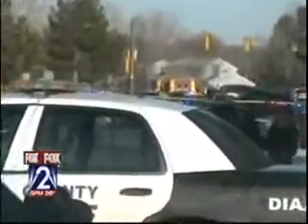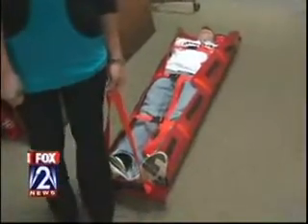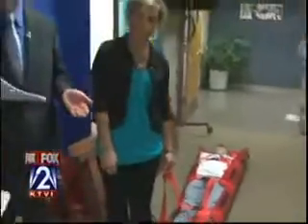And it's emergencies like these where seconds count. Schools are always practicing disaster preparedness, whether it be for a flood or something like that. Yeah, and then occasionally a new invention will come around, and that's what we've got here. They are using this in the Rockwood School District. It's called a med sled, and it's an emergency transportation and evacuation device.